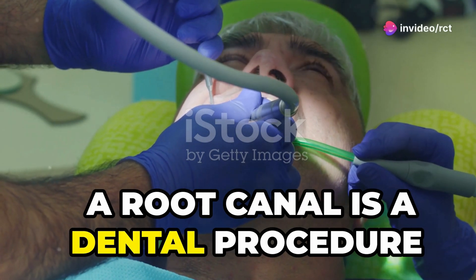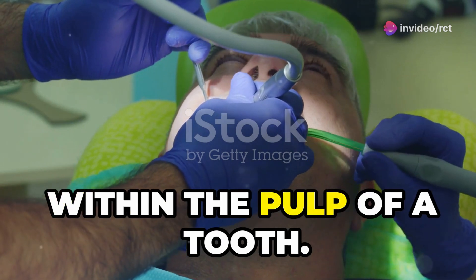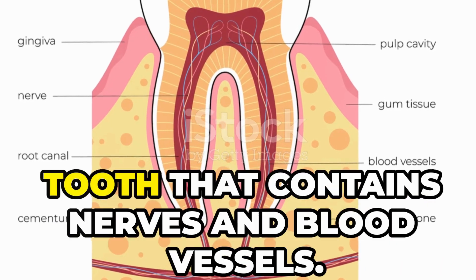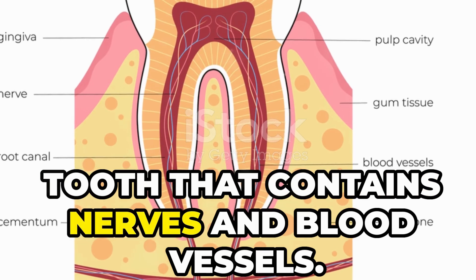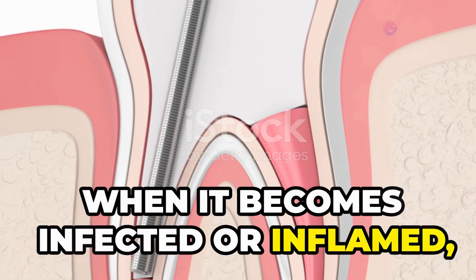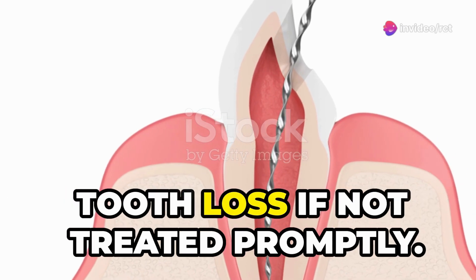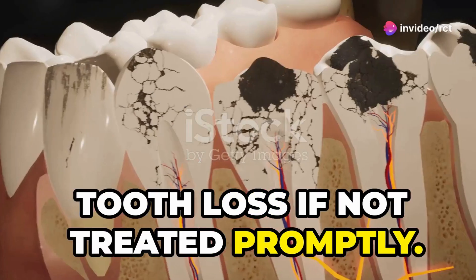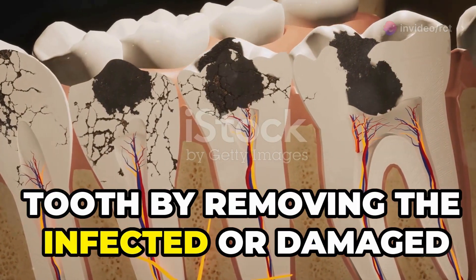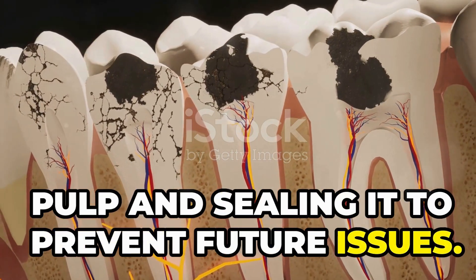A root canal is a dental procedure designed to treat infection or damage within the pulp of a tooth. The pulp is the soft tissue inside the tooth that contains nerves and blood vessels. When it becomes infected or inflamed, it can cause severe pain and even lead to tooth loss if not treated promptly. The goal of a root canal is to save the tooth by removing the infected or damaged pulp and sealing it to prevent future issues.